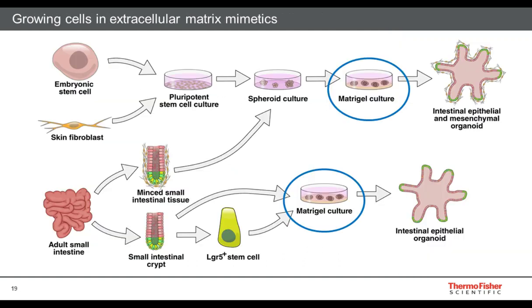So another thing to be aware of is that many of the 3D cell culture models, especially on the organoid side of the 3D cell model space, use extracellular mimics or matrices for growing these models. These are used to sort of encase the cell aggregates in order to help promote further maturation or some of the structural organization that people have reported and are commonly seen in various types of organoid models. Culturing in the ECM is a very important component of that system.